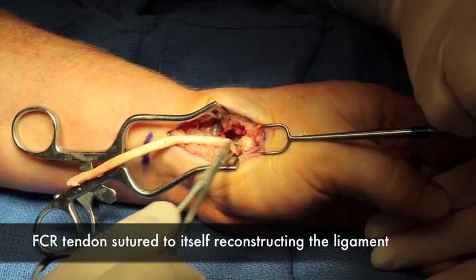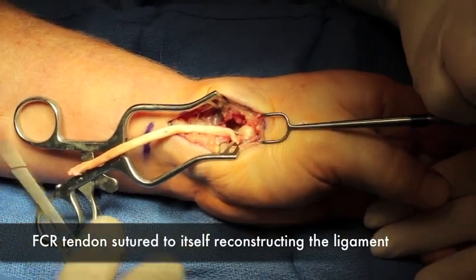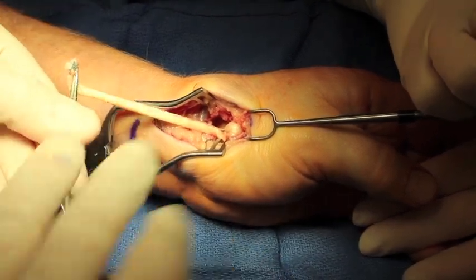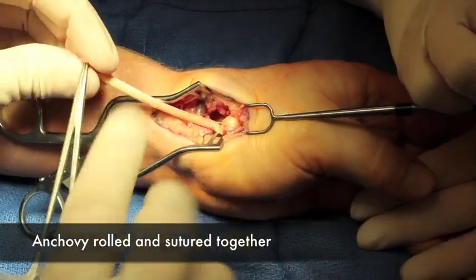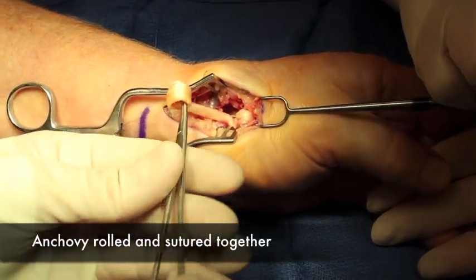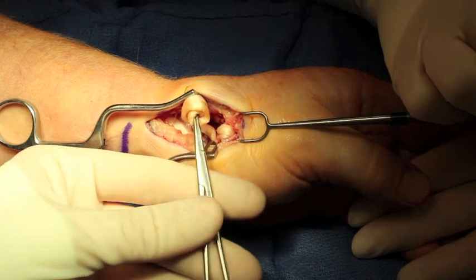Here it's been sewn down onto itself, and the remaining portion of the flexor carpi radialis is rolled onto itself and then sutured into position, creating a spacer between the thumb metacarpal and the remaining bones of the wrist.